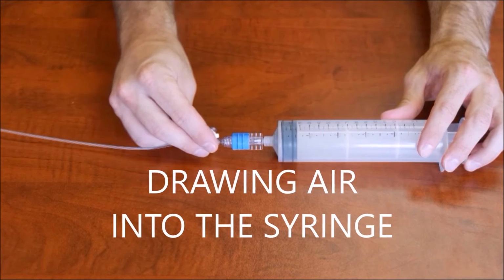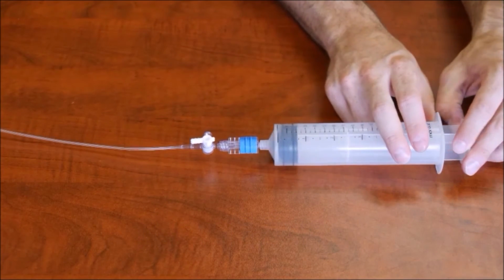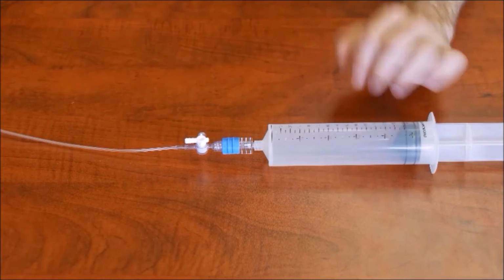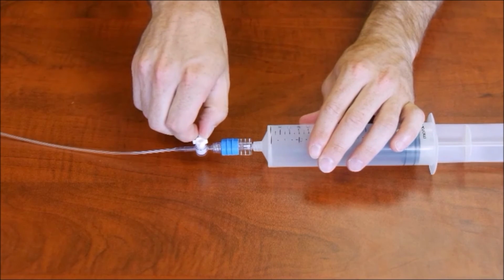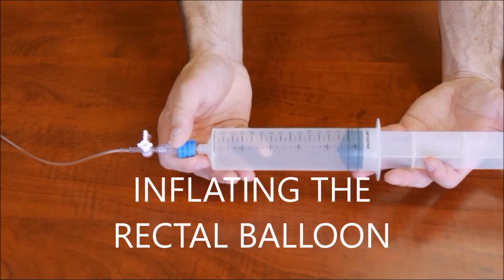Make sure the luer lock is in the off position and the flow control switch is in the on position. Then draw back the desired level, in this case a full 140 cc's. When the syringe is at the desired level, switch the flow control switch to off and move the luer lock to on. Once the luer lock position is turned on, switch on the flow control switch and you're ready to inflate the balloon.